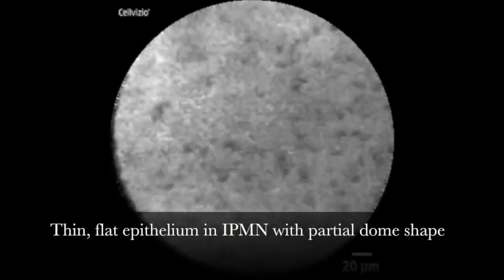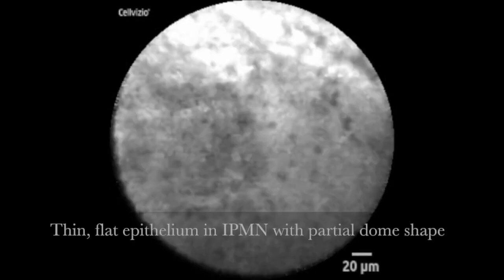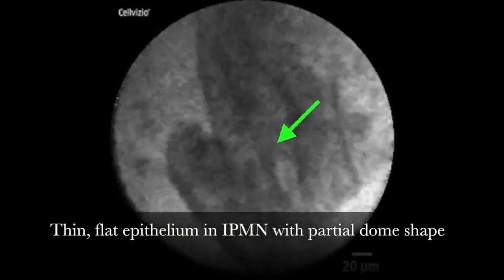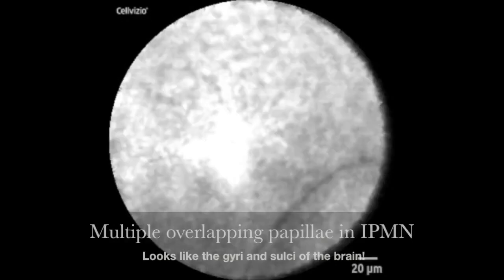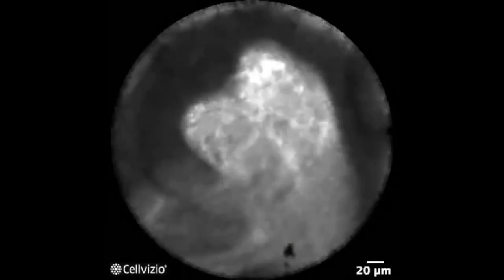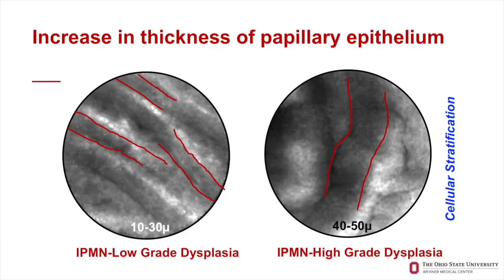Here in these videos, you see much flatter, thinner epithelium, a feature of IPMNs with low-grade dysplasia, and you will see IPMNs with multiple papillae. It's overlapping papillae as seen in this video, and sometimes it looks like the gyri and sulci of brain. Another example with some beautiful looking papillae in a case with IPMN.